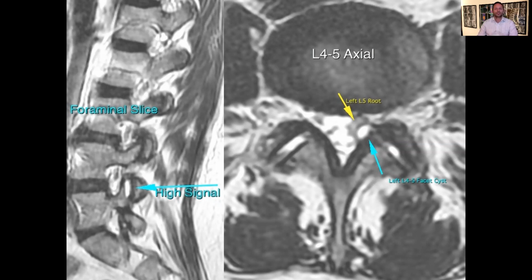If I'm honest, ultrasound is not very good for disc lesions because it cannot go beyond the depth of the bone, obviously, the lamina especially, and the facet joints, where behind is where the nerve is. So it wasn't an ideal treatment to do at the time. She wasn't improving, so she came along for a second opinion.